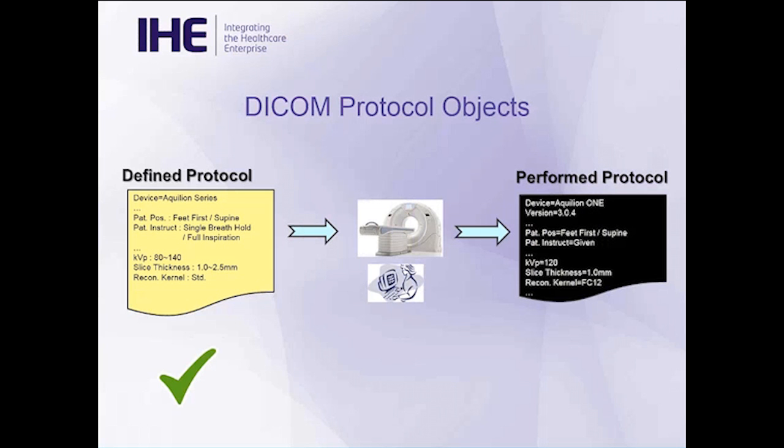We are including the defined protocol in this profile. We are not yet including the performed protocols. So we kind of wanted to go step by step, let people ease into this. And so the profile currently addresses defined protocols. There are suggestions on the table to bring in a performed protocol option later, which would also then involve the modality storing the specific protocols used for each and every patient, but that'll be a future thing.